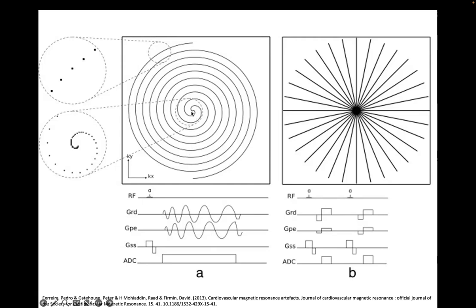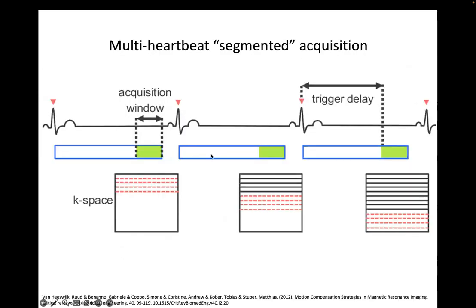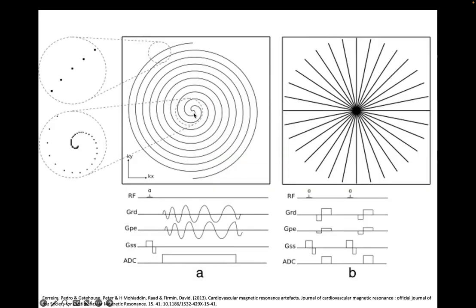And what that does is it puts me on a trajectory. I start at the middle and it spirals. And it basically spirals us out in k-space like this as that oscillation occurs, right? And while that's occurring, I basically sample voltages from my receiver coil and record that signal. And when I put that recorded signal back into the plane like this, I generate the Fourier transform of the object.